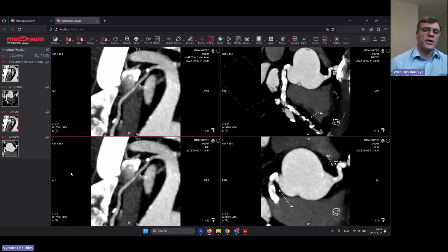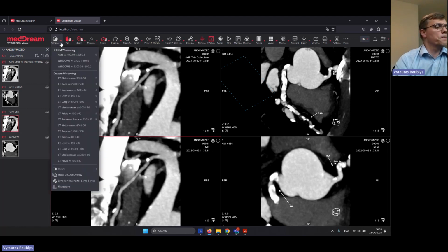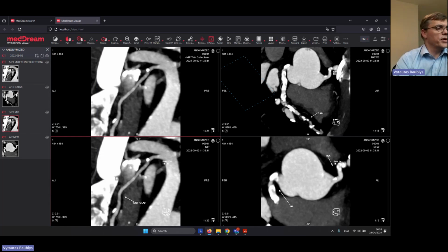At this stage, we created selectable overlays. In the future, definitely there will be the possibility to unselect all overlays or select all overlays. But at this point, just to deliver the function faster to clients, we created the possibility that you selectively control how the markers are shown.